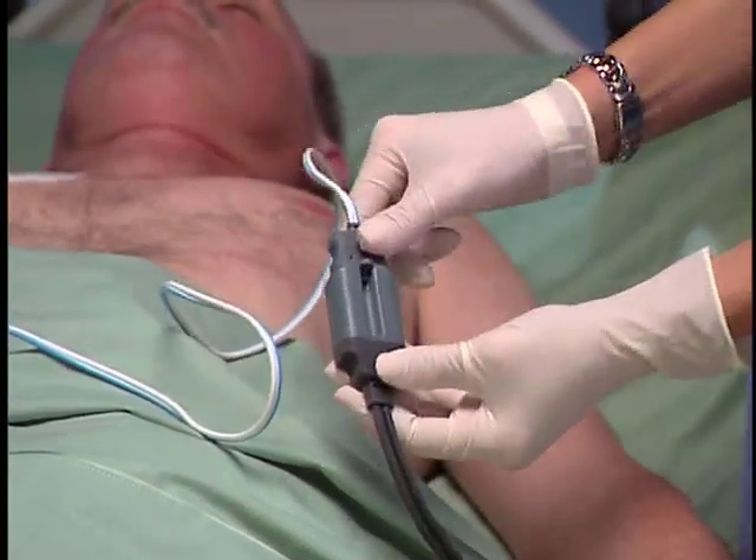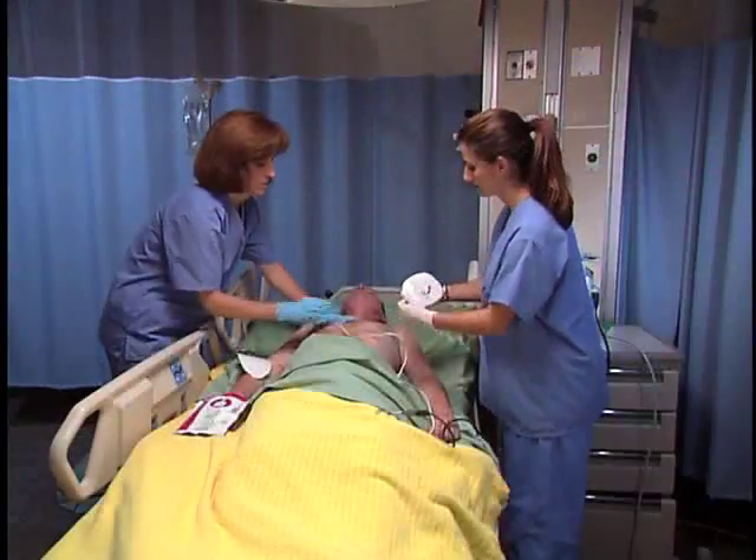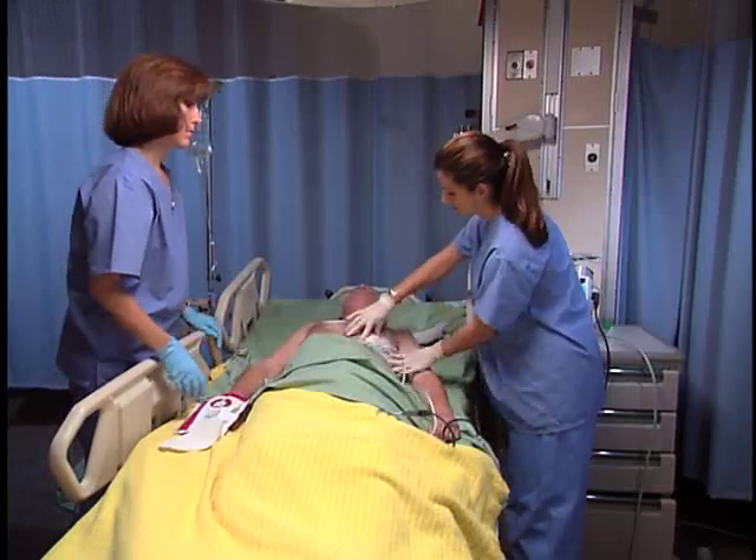Connect the pads to the pads patient cable. Apply the multifunction electrode pads as directed on the package.